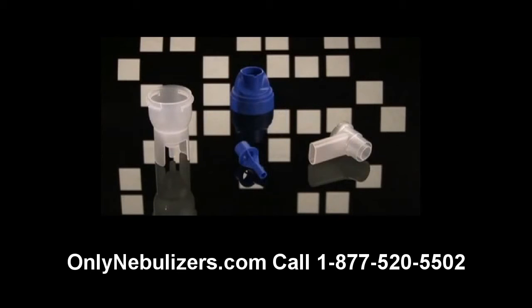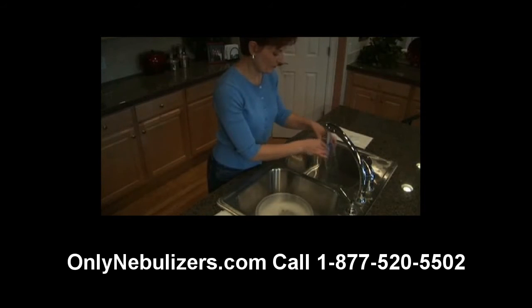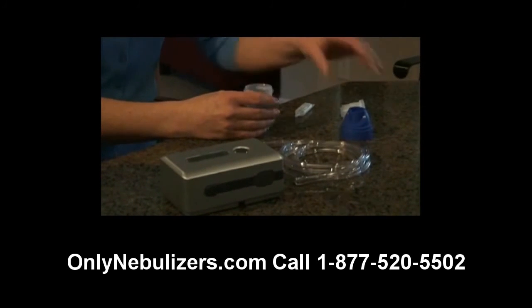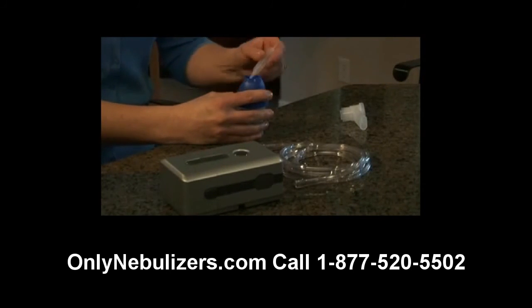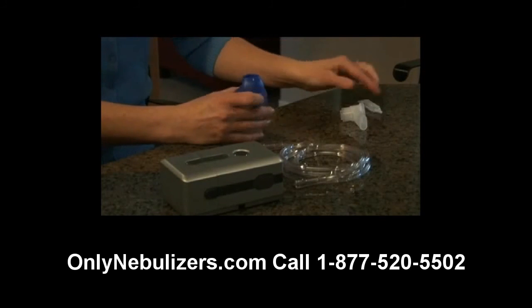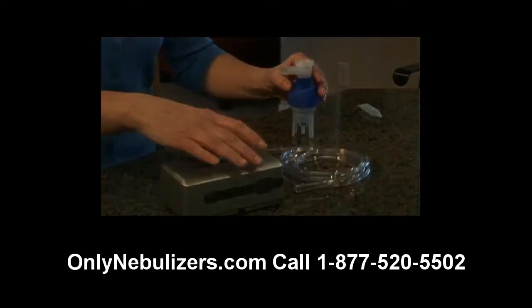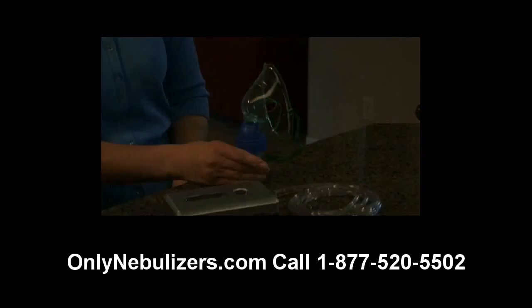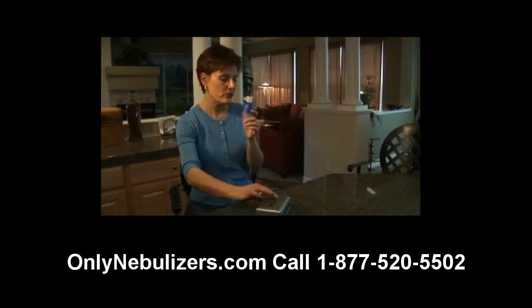The reusable nebulizer consists of a mouthpiece, cap, medication cup, baffle, and tubing. Before you use your nebulizer for the first time, clean all parts by following the instructions provided later in this video. After washing your hands, insert the baffle into the nebulizer medication cup. While holding the cup, attach the nebulizer cap by turning clockwise. Next, add the prescribed dosage of medication into the nebulizer through the large opening in the top of the nebulizer cap, and attach the mouthpiece to the cap by pushing gently straight down. If you're using an aerosol mask, place the mask adapter directly into the top of the nebulizer cap. Finally, attach the tubing to the nebulizer air inlet connector.